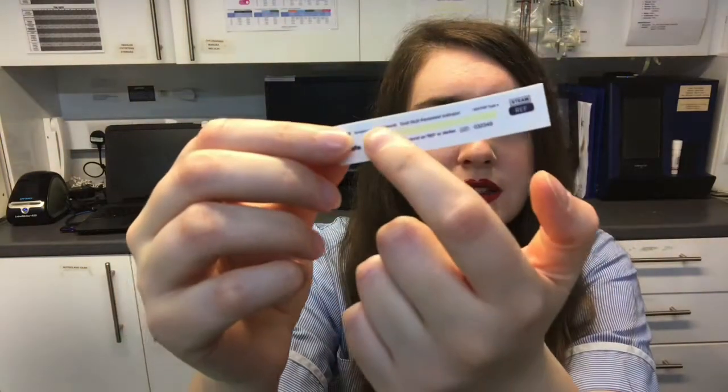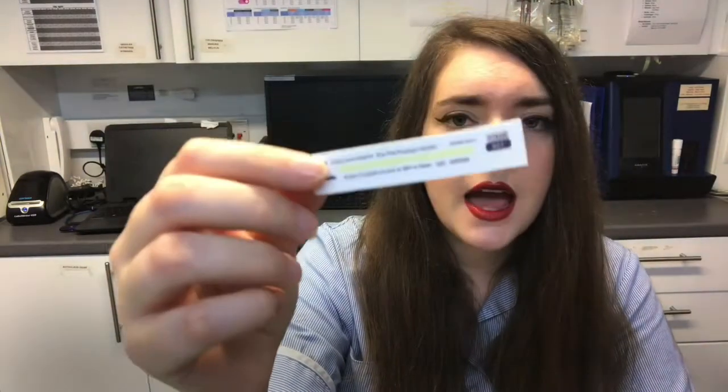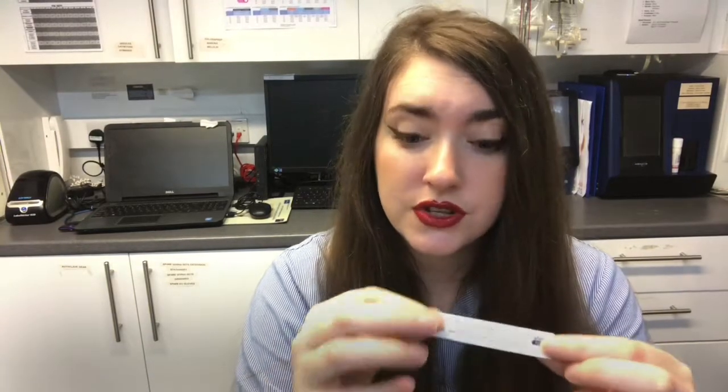We also have an indicator strip here. This will change colour — this yellow part will go black once it's been sterilised — and it lets the nurses and the veterinary surgeon know that this has been sterilised and is good to use for surgery.